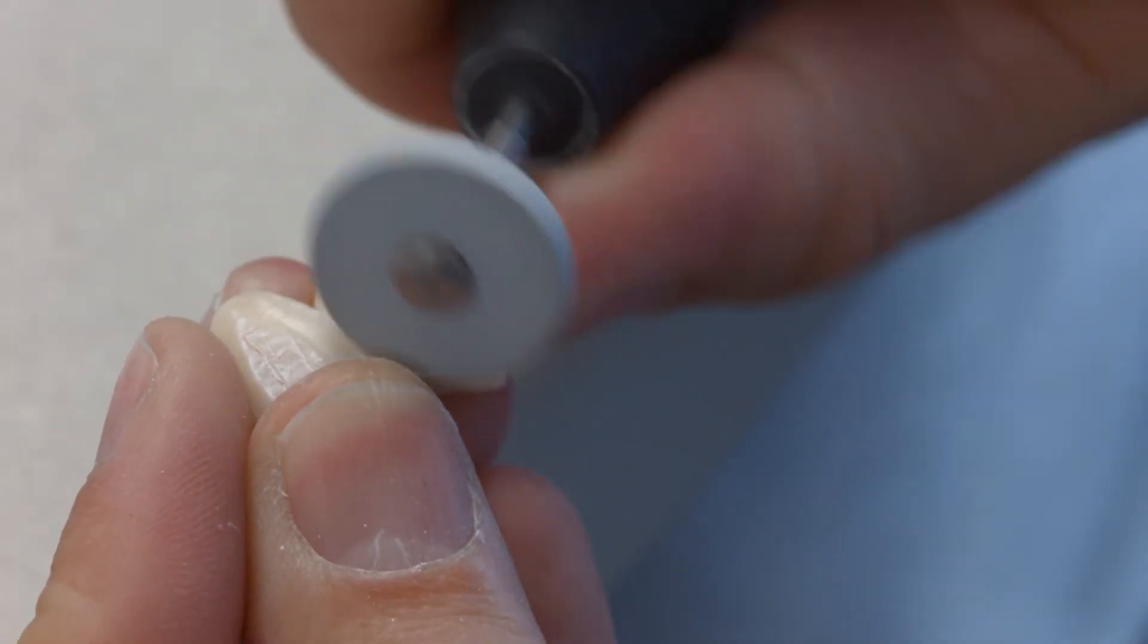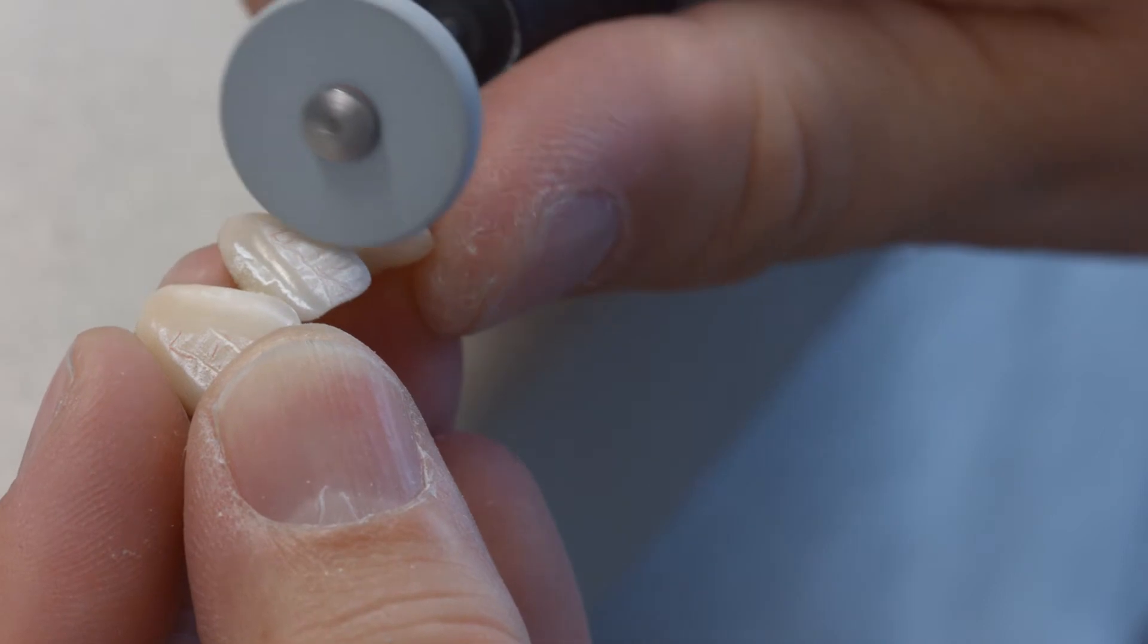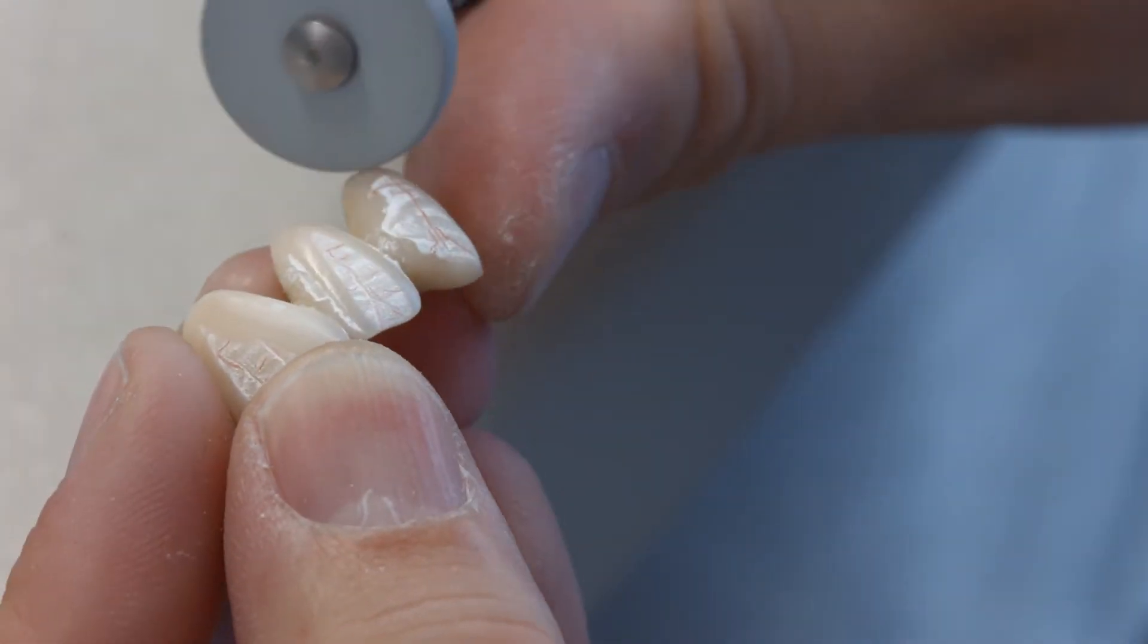Elevated spots and areas that are to show a stronger gloss after glaze firing can be pre-polished using silicone polishers.